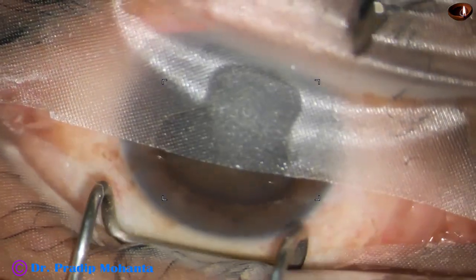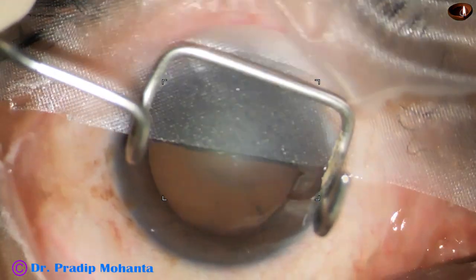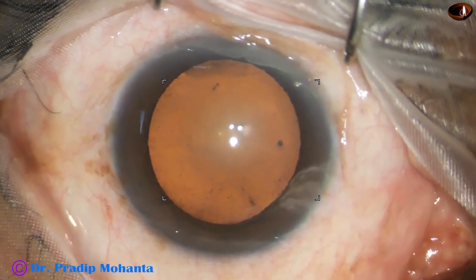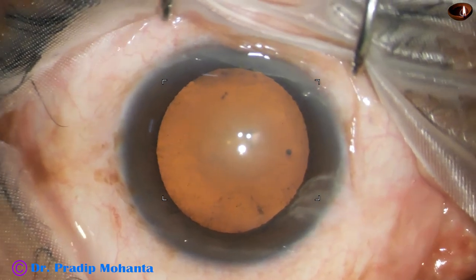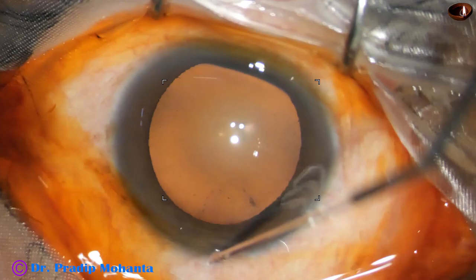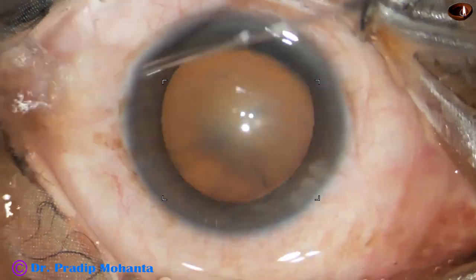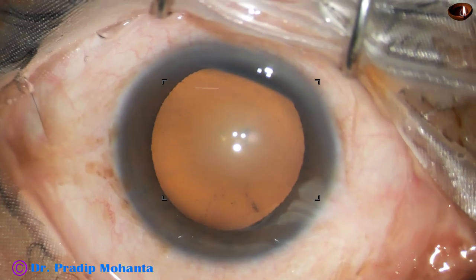Nice draping is very much important. The lid margin should be nicely covered — no eyelash should project into the operating field. The ocular surface is thoroughly irrigated by instilling a few drops of 5% povidone iodine.